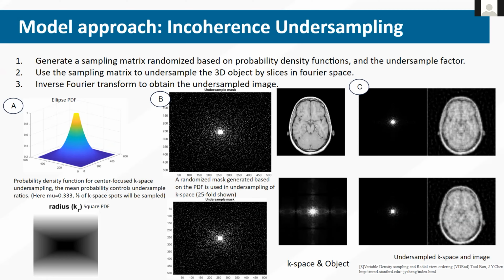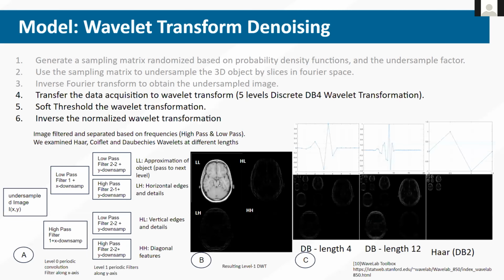The resulting K-spaces are shown in figure C with the inverse transformed undersampled image. We will talk about the differences in compressed sensing results brought by undersampling strategies. But for here, these two types of undersampling mask did not show significant differences in the results.